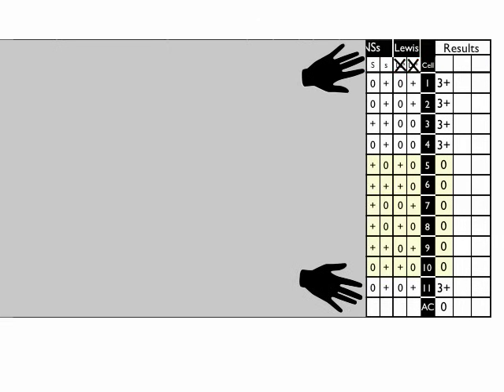Okay, either way you do it, you move on to your next pair, which is big S and little s, and you do the same kind of thing. In cell 5, a double dose rule out for big S, cell 6, no rule out because it's heterozygous, cell 7, another double dose rule out for big S, cell 8 we don't need to look at because we already did the rule out.